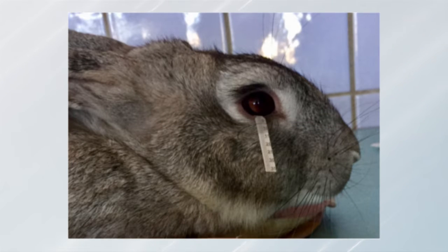Rabbit model Schirmer tear test. Over a period of several days to weeks, tear production is markedly reduced. Decrease is measured using the Schirmer tear test. The cornea is examined regularly with slit lamp microscopy and tear breakup test. The effectiveness of various test articles may be determined whether they are applied directly to the eye or administered systemically. This is done by measuring the tear production, the tear breakup test, and integrity of the cornea. At necropsy, the eye and the lacrimal glands may be examined histopathologically.